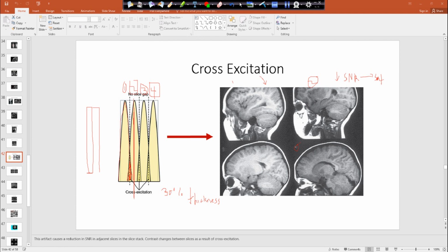But then, right before they started scanning slice 2, they repositioned. They didn't move throughout the scan. You know how some patients will be sitting there, but then they'll just have a quick little moment, and then they'll settle again. So that's what happened. There wasn't motion on one particular image, but as you flip through them, they were doing this. Okay, so that's what's happening.